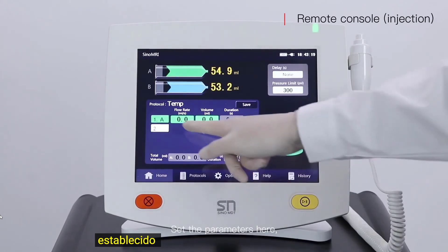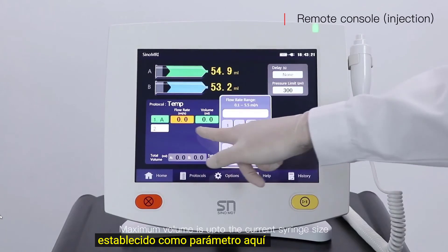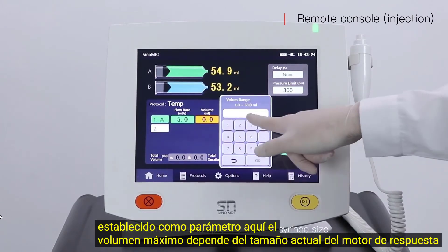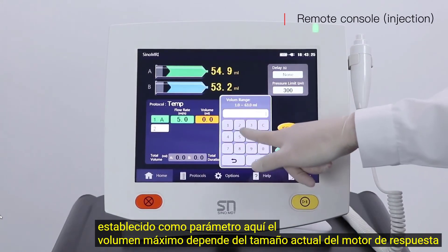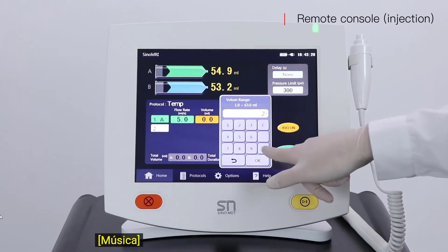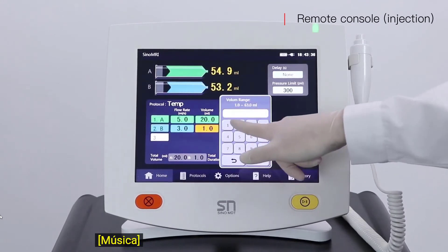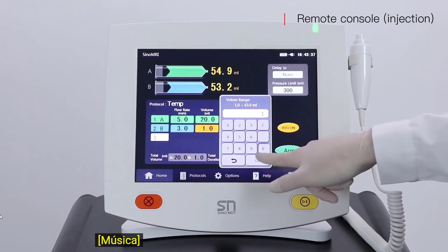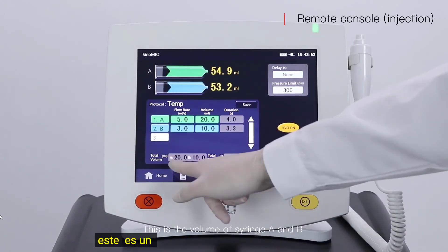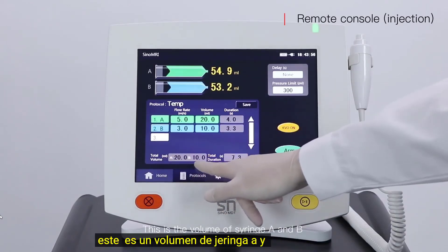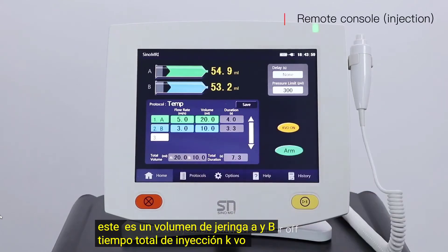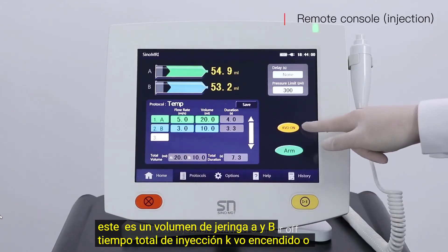Set the parameters here. Maximum volume is up to the current syringe size. This displays the volume of syringe A and B, total injection time, and KVO on or off.